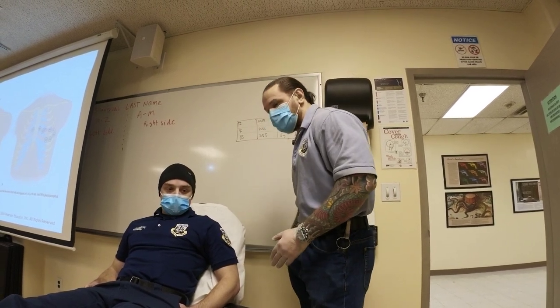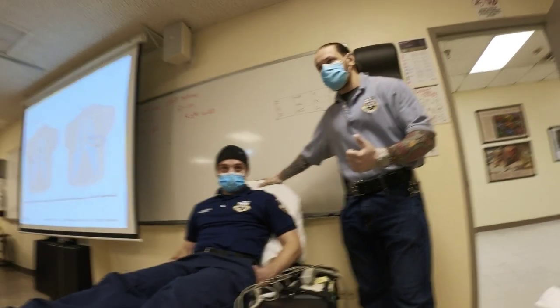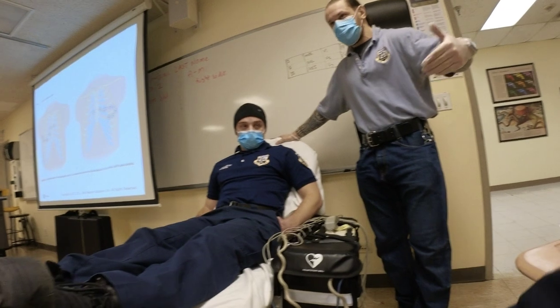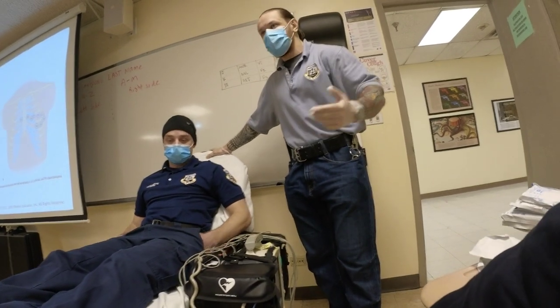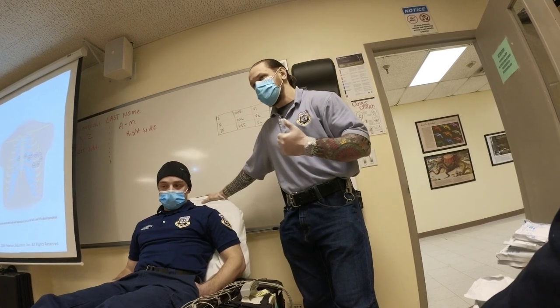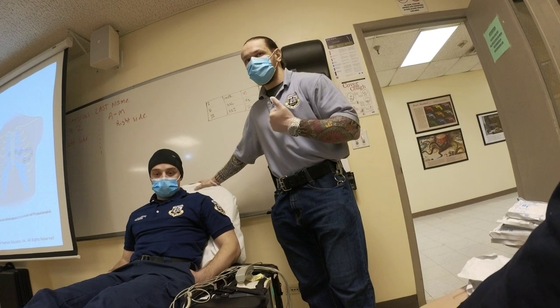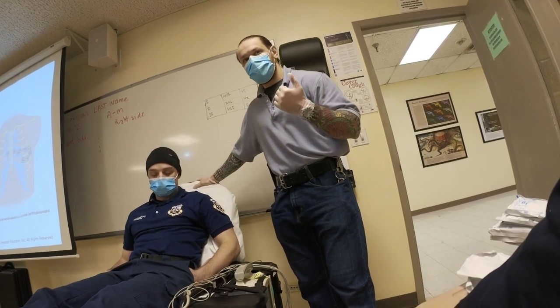So what you're going to do is, you notice how I placed them on the stretcher. Do not do 12 leads for your patients if they are on your bench in the ambulance or somewhere on the chair, uncomfortable in the house. They're going to be in pain. You're not going to get a good tracing and they may be moving. You may get artifact. I do not want artifact. I want a clean 12 lead.